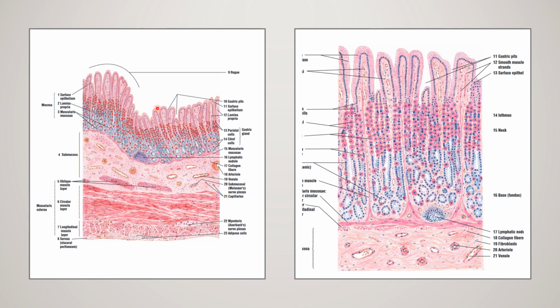Next important point you have to see in mucosa is that epithelium dipping into the lamina propria. The site of dipping of the epithelium into the lamina propria is called the gastric pit. See that. These are all the gastric pits where your epithelium is dipping into the lamina propria. What happens to that epithelium after that? After dipping into the lamina propria, they are getting converted into glands.